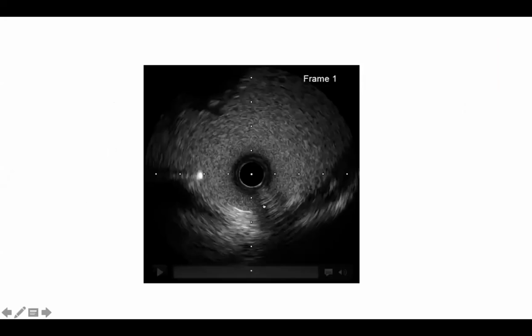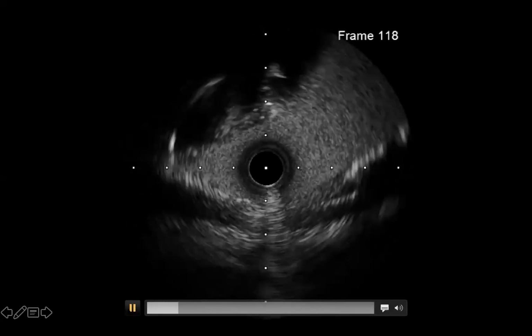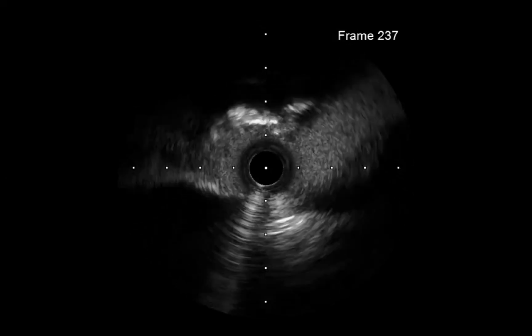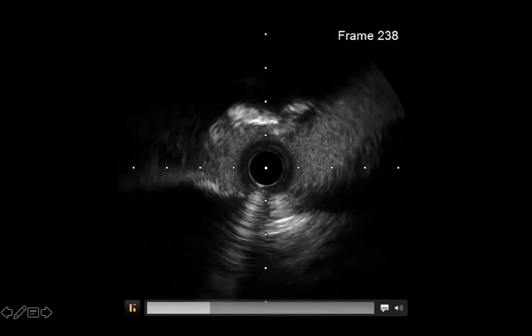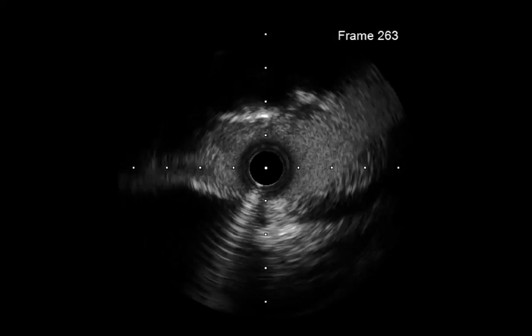But it can be an angle as well. You know that there was an angle in the left main, and it can be quite difficult to image with the IVUS. And although there is some suspicion in some frames that there is a lesion which may be significant.